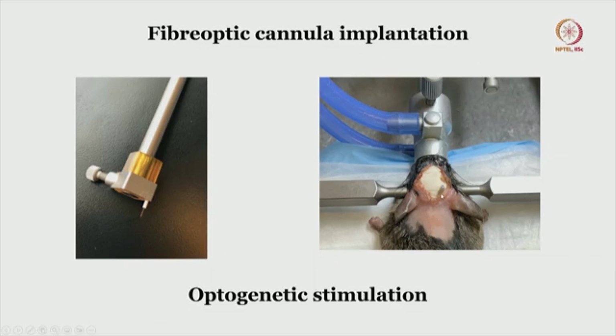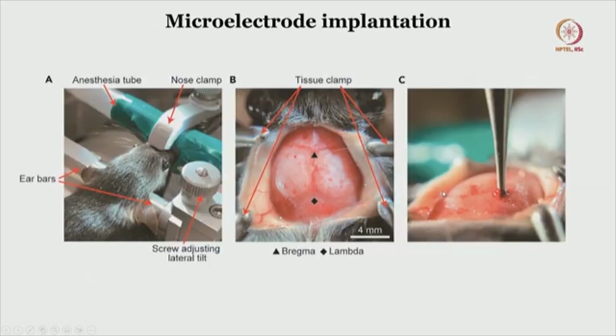Using a similar burr hole, the head has been fixed, and that is the anesthetic mask or tube for the rodent, which is used along with the stereotactic apparatus. The head is centered, then the burr hole is placed and the cannula is implanted, alright. So, those are a few examples.